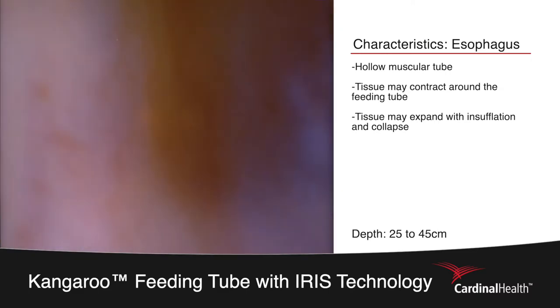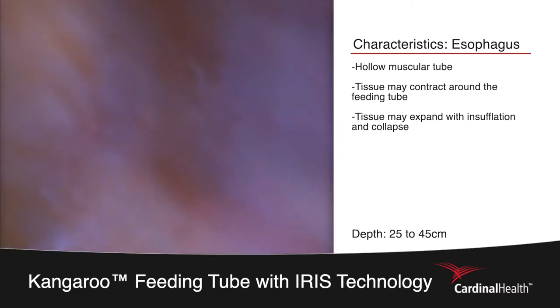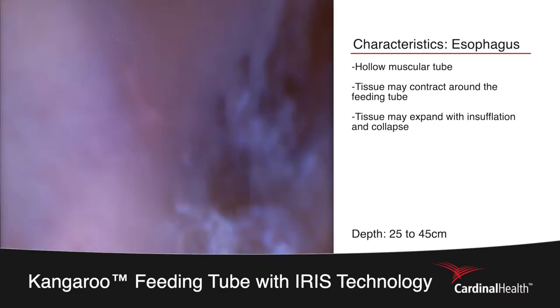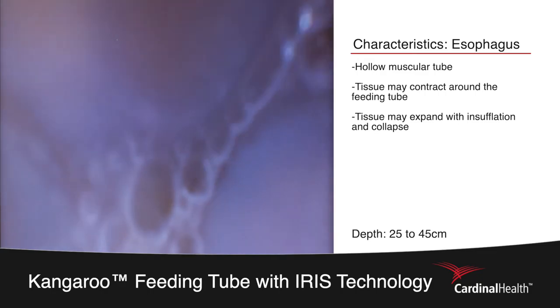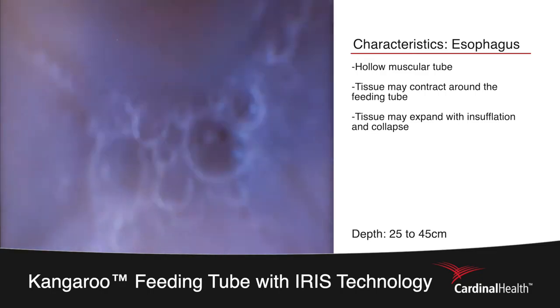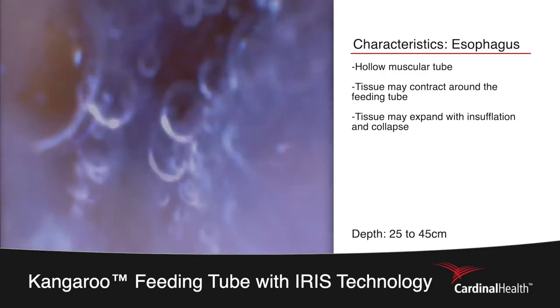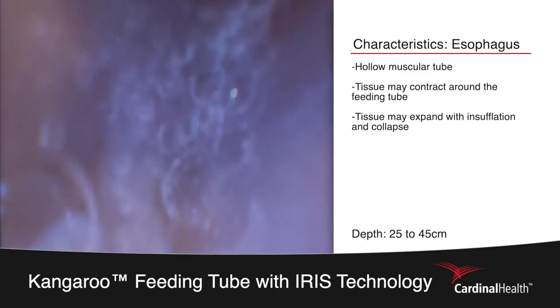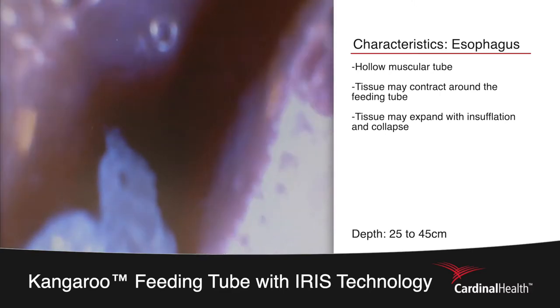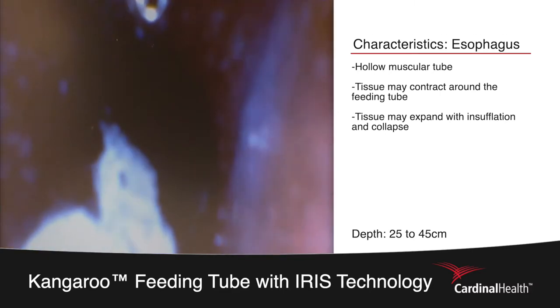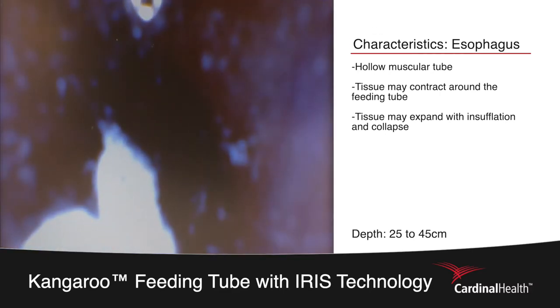At around the 30 centimeter mark we will pause to determine that we are in the correct location. At this point you can add air utilizing the insufflation device to create space and then visualize the esophagus contract around the tip of the feeding tube.